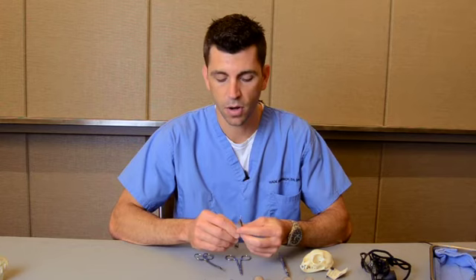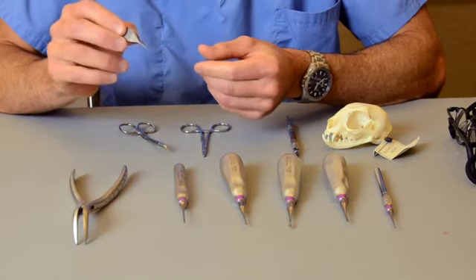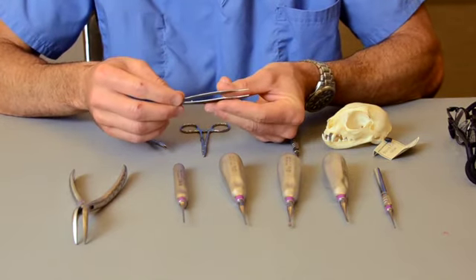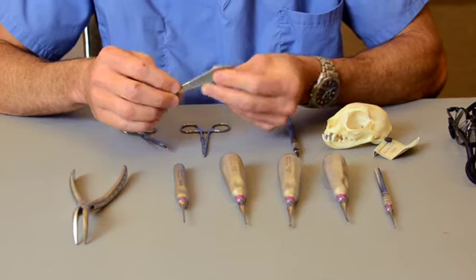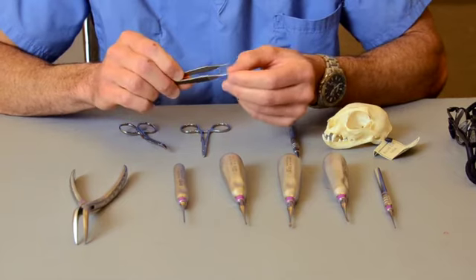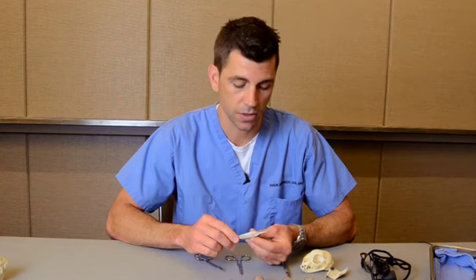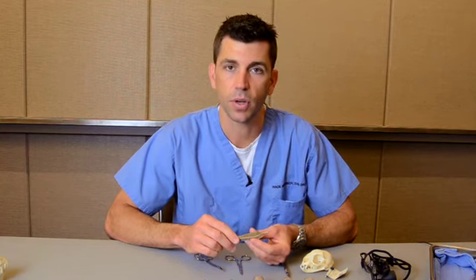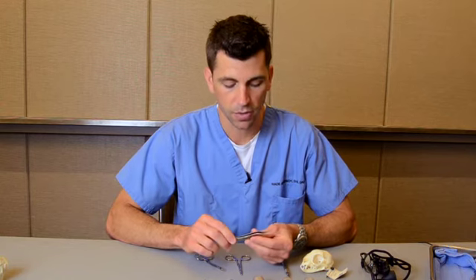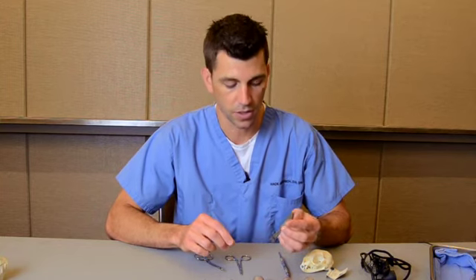Okay, I use a very fine DeBakey thumb forceps. This is much different than a larger, heavy serrated type of Addison Brown forceps. This is considered a DeBakey style forceps. It's got very soft or non-aggressive type of serrated tip. And the advantage of using this in feline surgery is that feline gingiva and mucosa is very fragile. And this is going to reduce some of the trauma to the tissue. And you're going to have improved healing when you use this type of instrument, and reducing some of the unnecessary types of stresses and damage to the tissue.